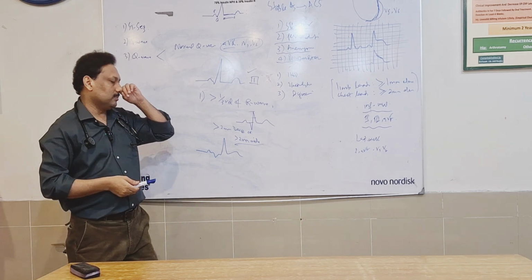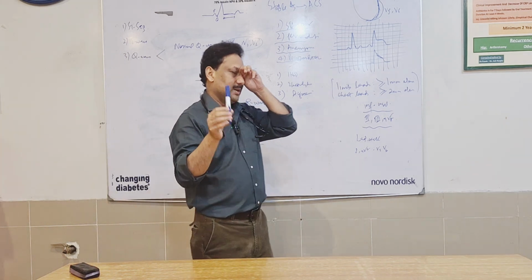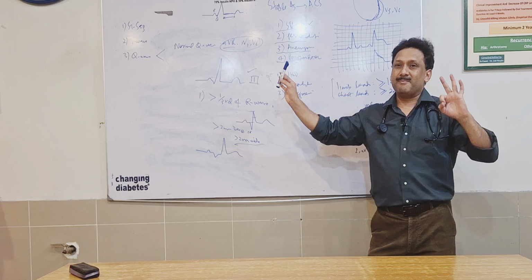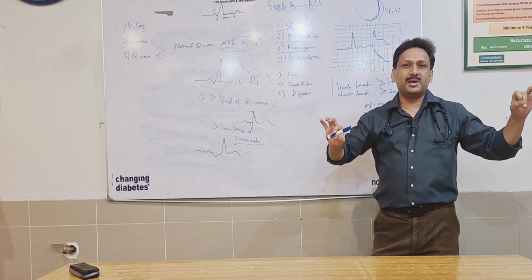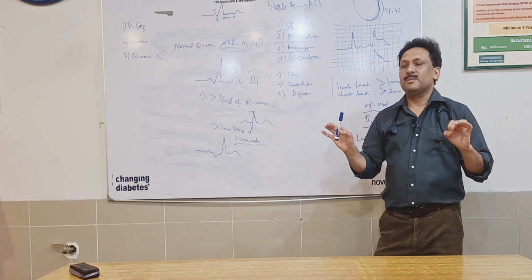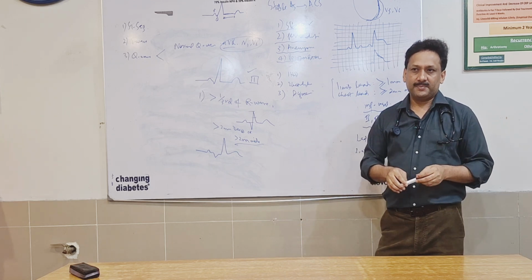So this is all about Q waves, ST segment, T wave. As I told you, remember, Q waves can be normally there, T waves can be normally there, but only in certain particular leads. Thank you very much.